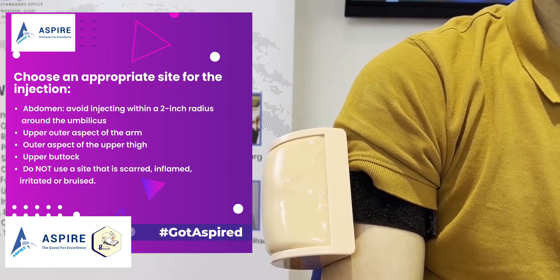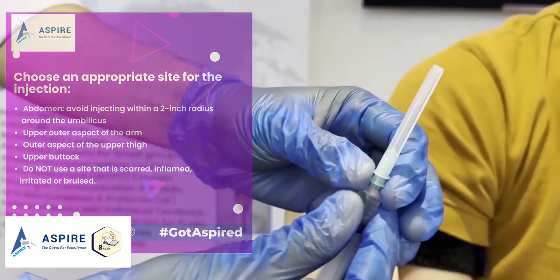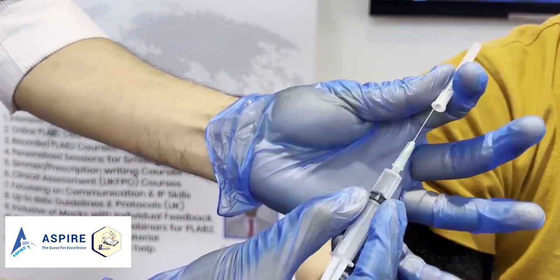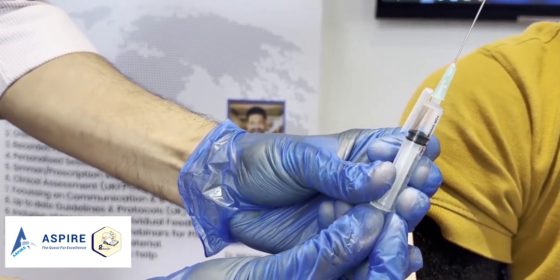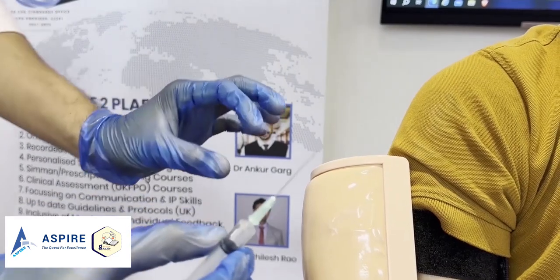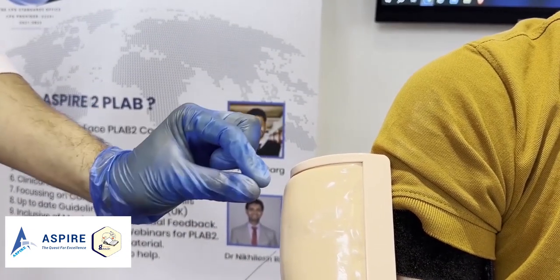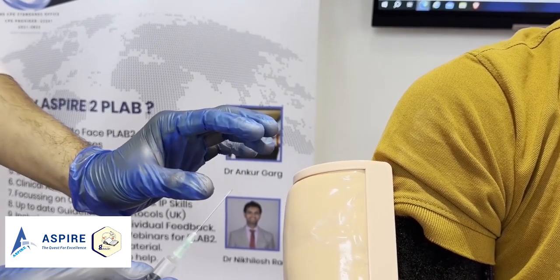Before starting the injection, make sure there are no bubbles in the syringe — that's the main thing. Also, when giving a subcutaneous injection, you don't need to clean the area with an alcohol swab; you can directly inject, and that's absolutely fine.